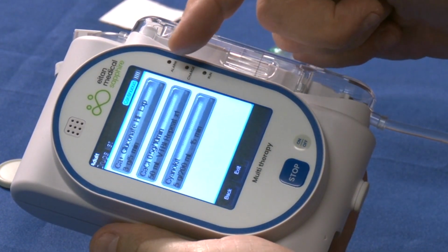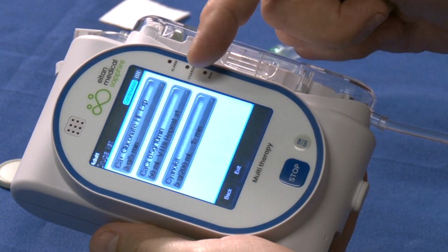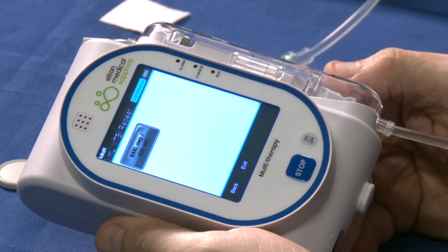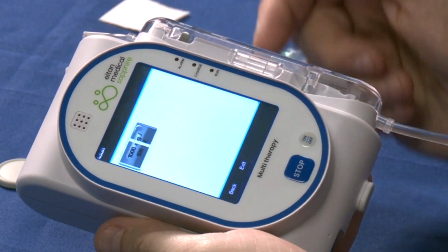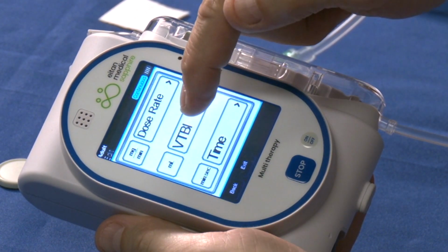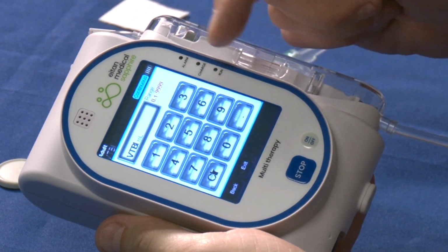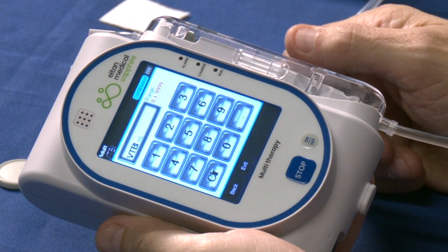Select calcium chloride, 0.5 grams per 10 minutes. Select 1,000 milligrams per 100 milliliters. Select volume to be infused. Calcium chloride is an exception to our rule of entering the size bag we are infusing. If we were to input 100 milliliters, the pump would infuse all of the medication.